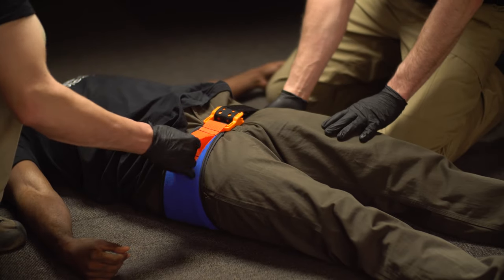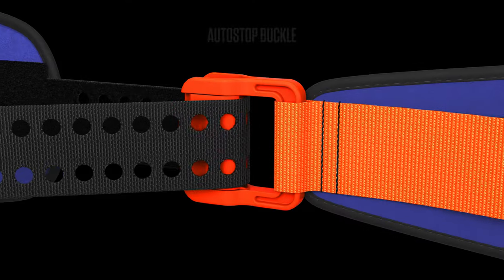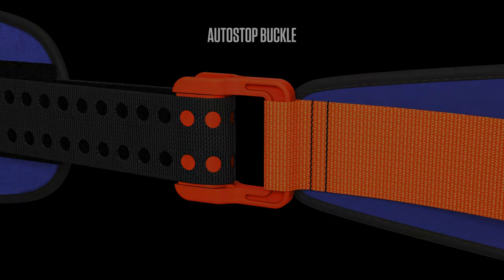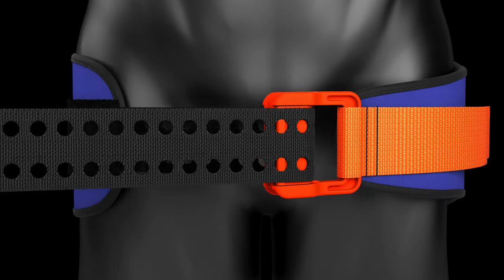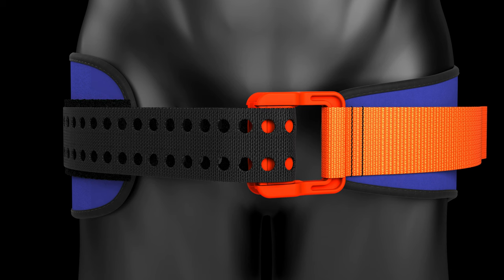Leave SAM Pelvic Sling in place until directed by a medical practitioner. The patented SAM Auto-Stop buckle acts to avoid over or under tightening of SAM Pelvic Sling. Once optimal compressive force is reached, two prongs activate, clicking to confirm correct application.